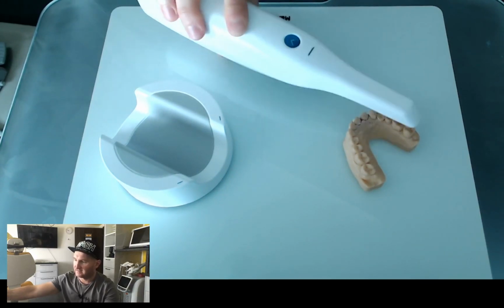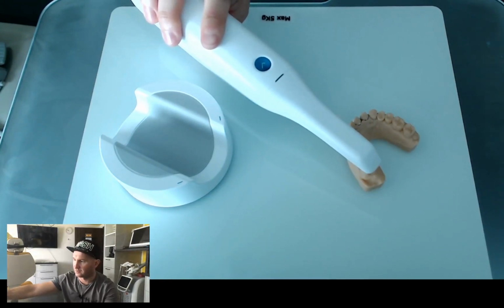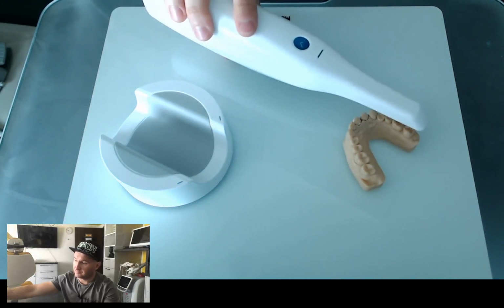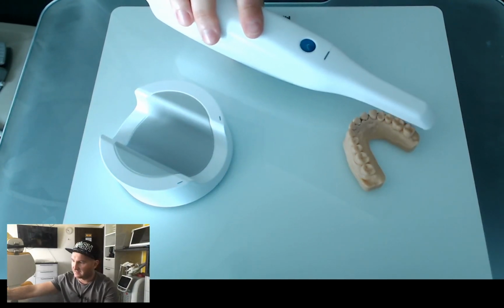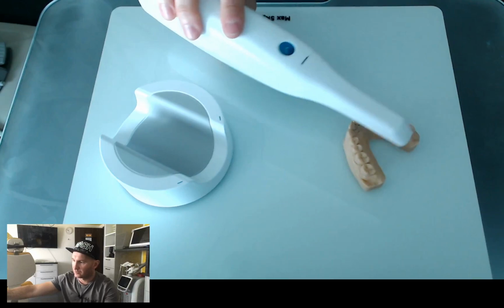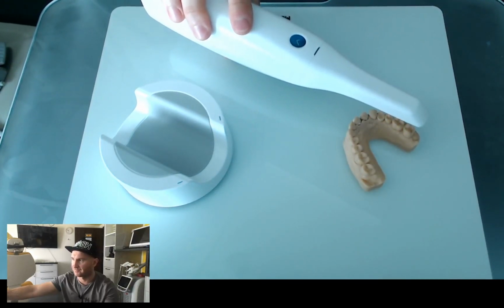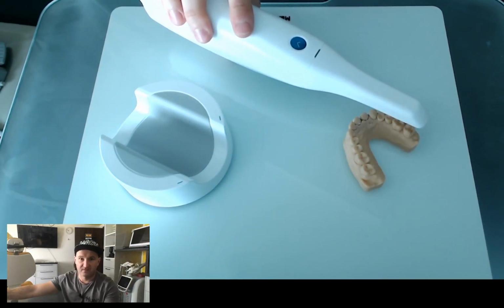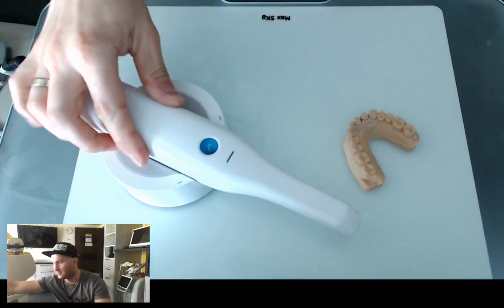So by the time the scanner sees the other side of the teeth arc, I cannot say that it forgets, but it does not have those two images in one shot, on one photo, on one area. So this may cause some problems, which I am going to show you in the video.